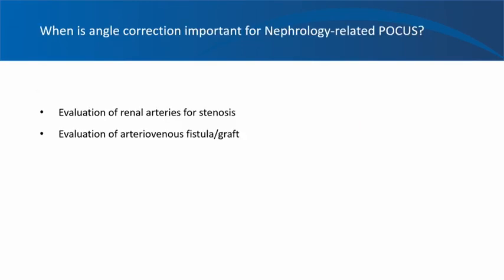So the next question is, when is the angle correction important for our point of care purposes, especially from the nephrology standpoint?